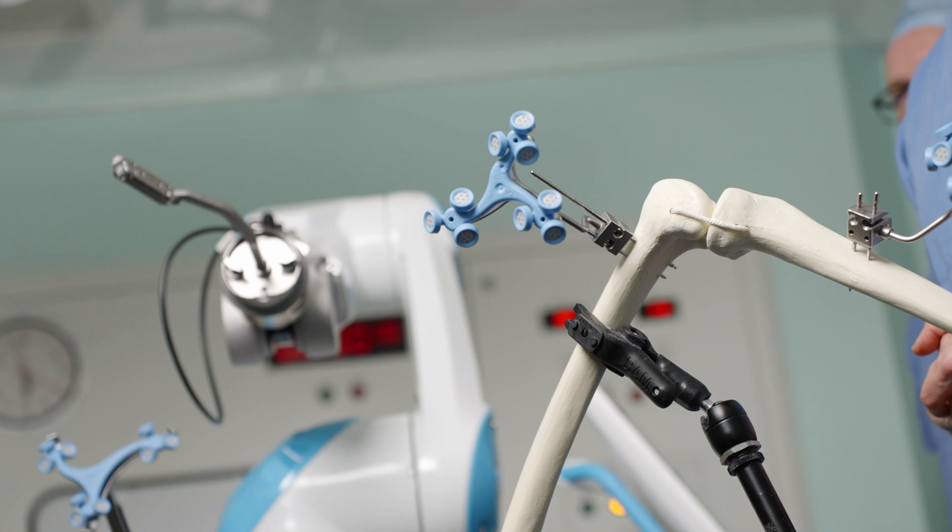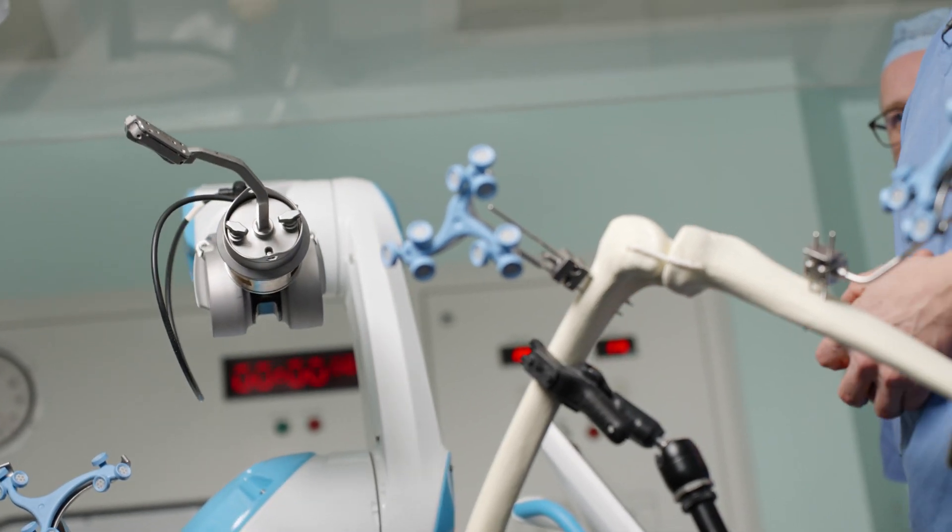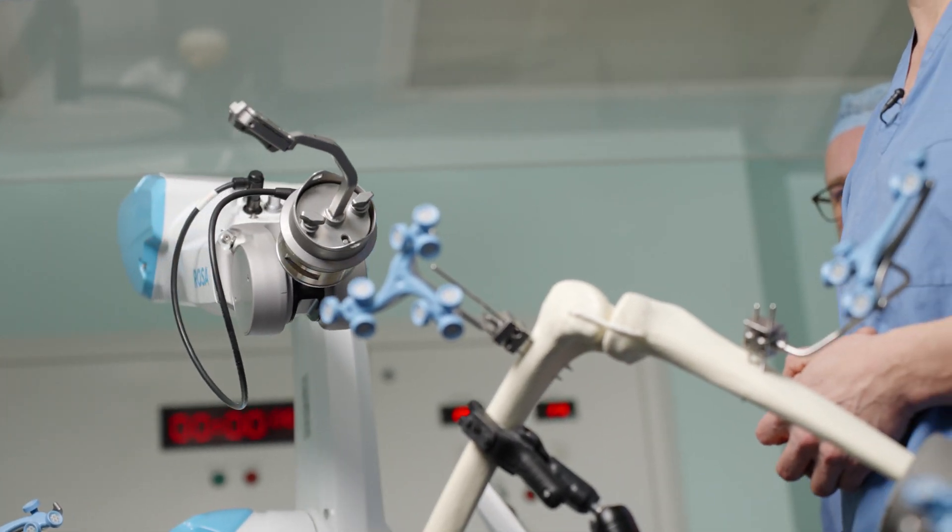From a recovery point of view, the initial phase is very similar to a standard knee replacement. However, hopefully you'll have slightly less pain and a quicker recovery because what we hope to have achieved is a perfect leg alignment and perfect ligament balancing. Your knee replacement should feel a little bit more natural than one that's just been put in a generic position.